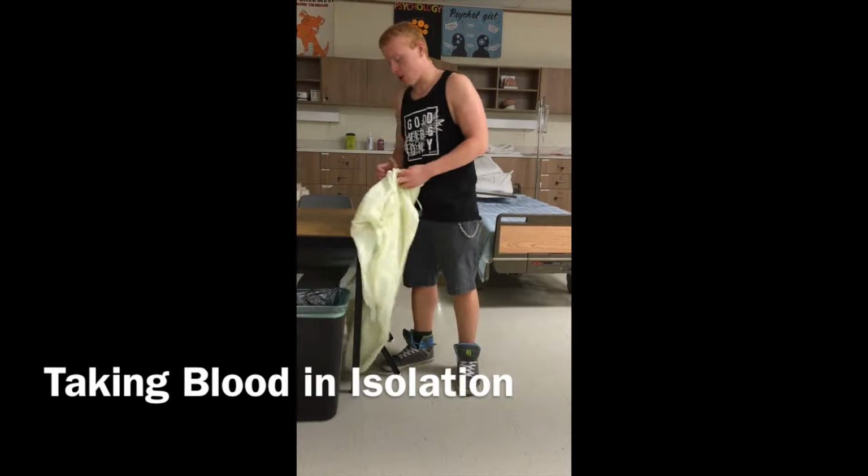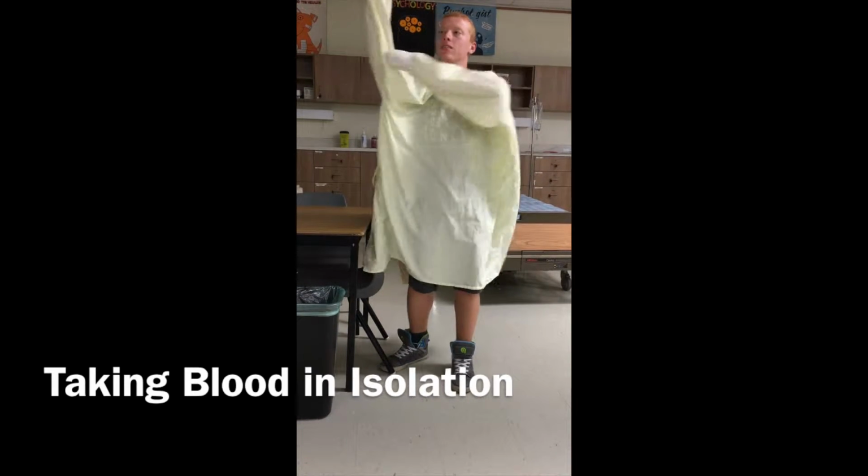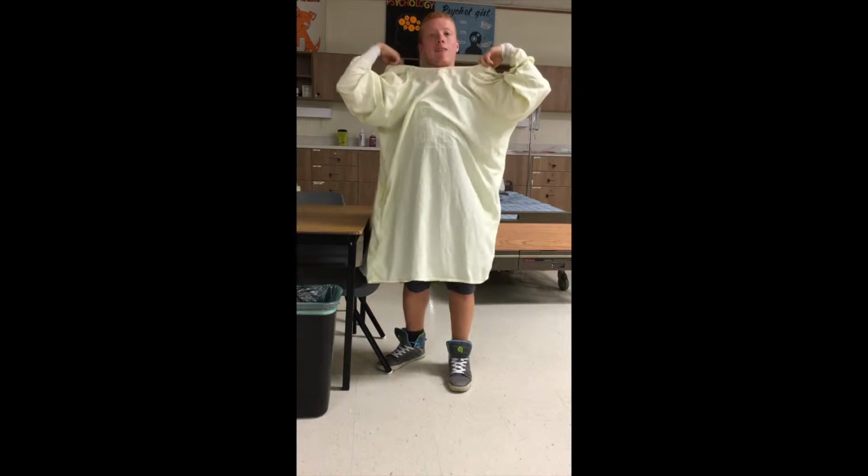Setting up for contact isolation. So first, you throw on your gown. Make sure everything is tied.